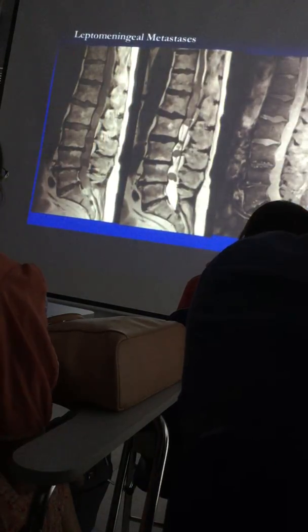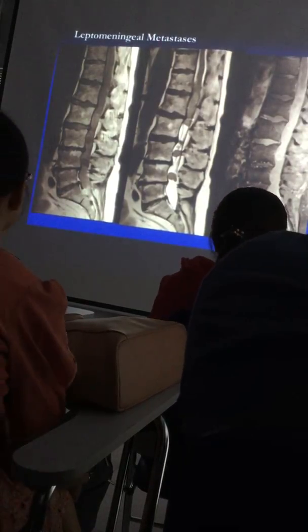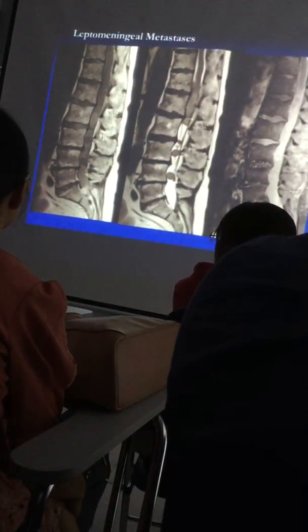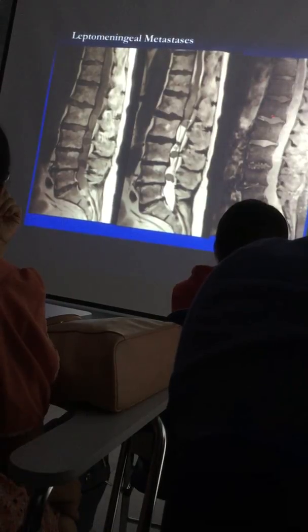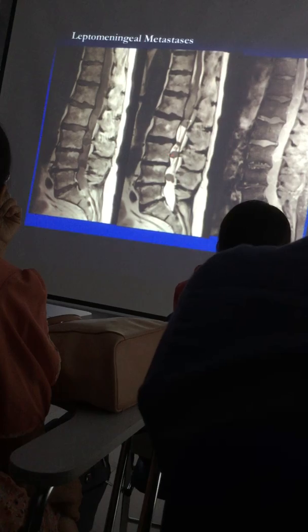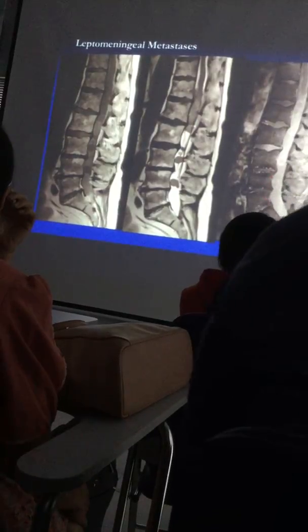Okay, so then we've decided with those intradural extramedullary lesions in the lumbar spine whether there's one of them or more than one of them. And in this patient you can see on the sagittal T1s, T2s and post-contrast T1s, there are multiple intradural extramedullary lesions in the subarachnoid space. This is the T1s. And when we give the patient contrast, everything enhances.